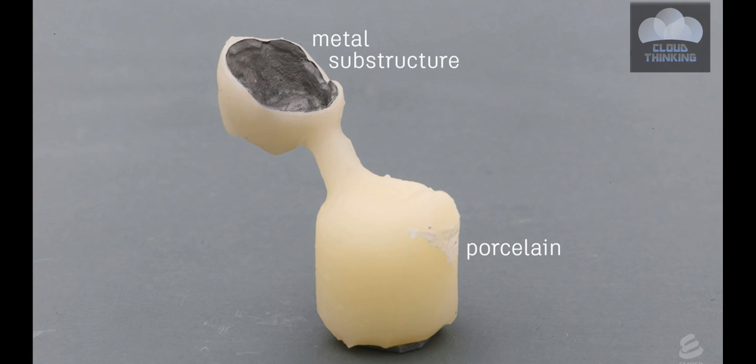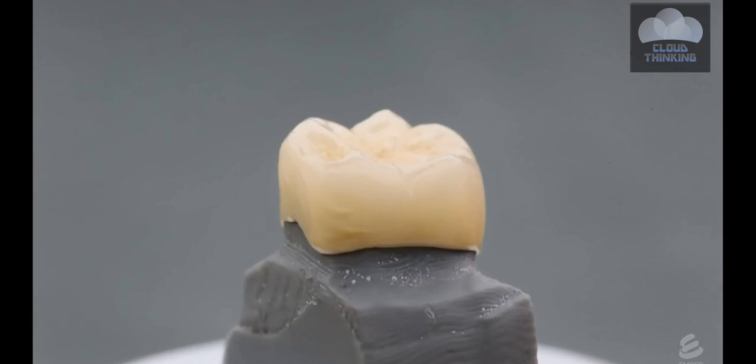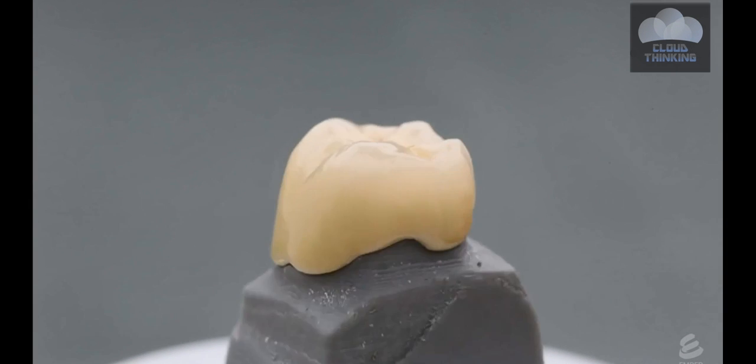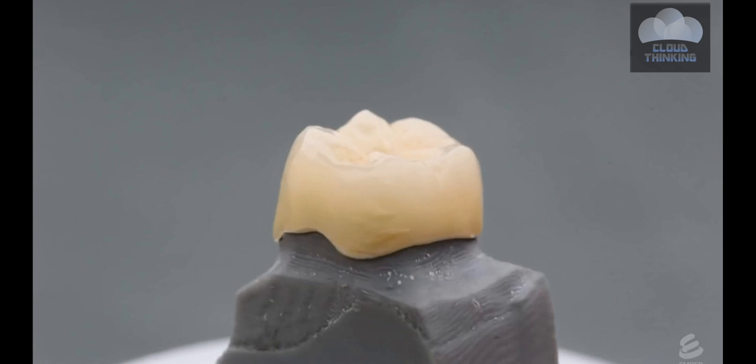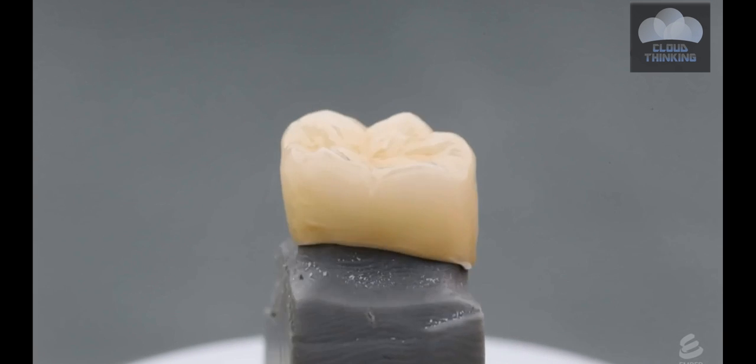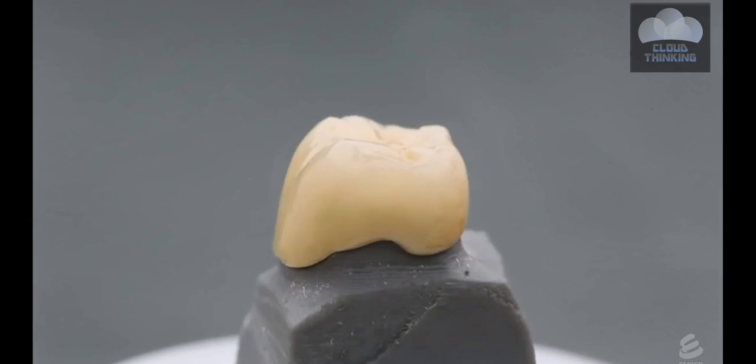They remove the sprue and the crown goes through some finishing steps, including detailed painting and glazing, which gives the crown a natural tooth-like appearance. It is now ready to be shipped back to the dentist, who will place it in the patient.